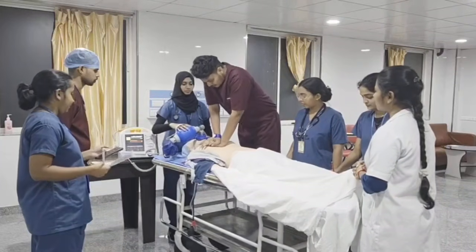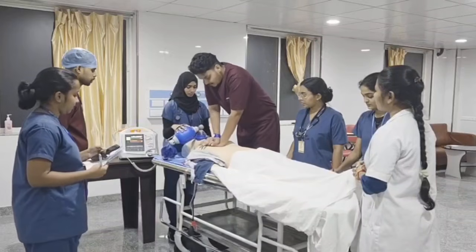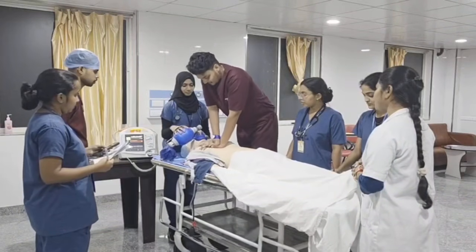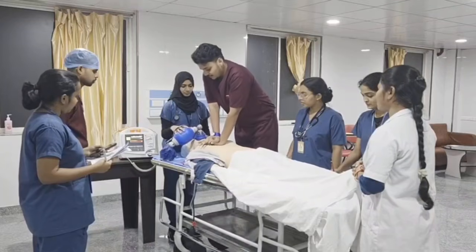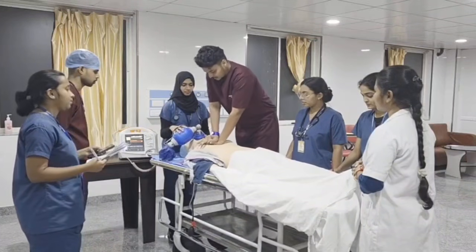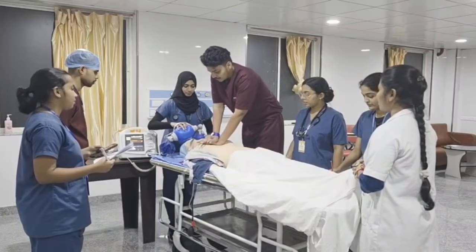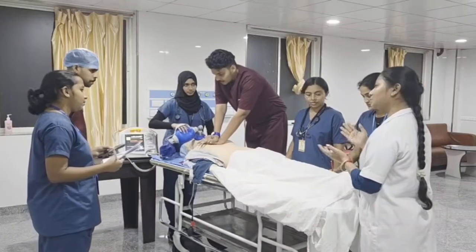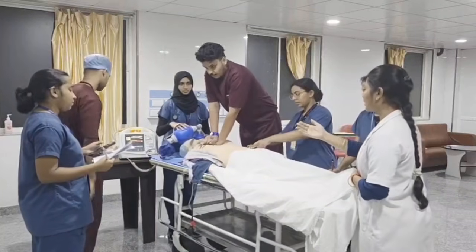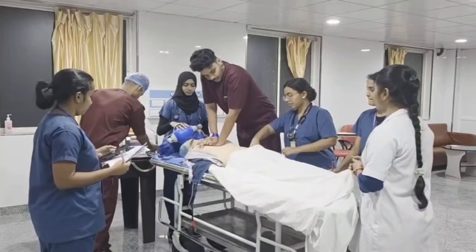Counting compressions: 1 through 30. Once 2 minutes are finished, you can switch over the compressors also. 15 seconds more. So you can pre-charge the defibrillator, and you can check for pre-pulse check over the femoral artery.